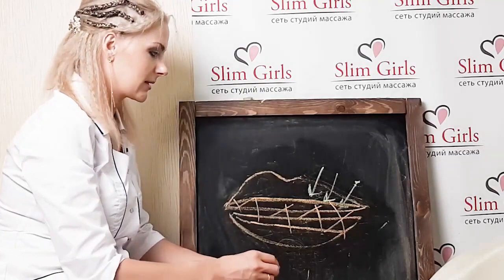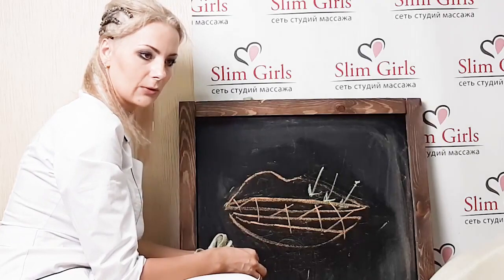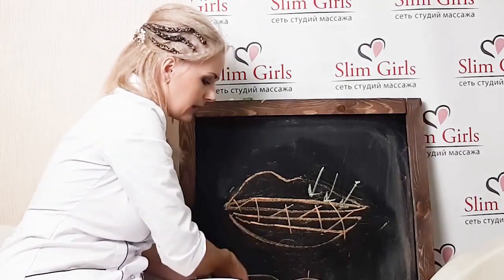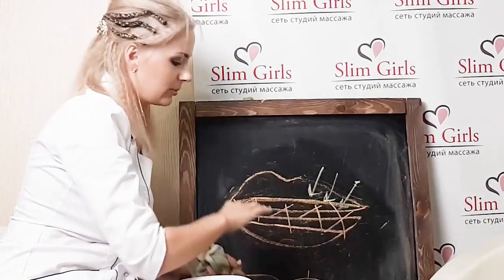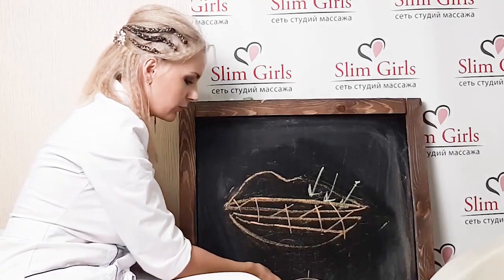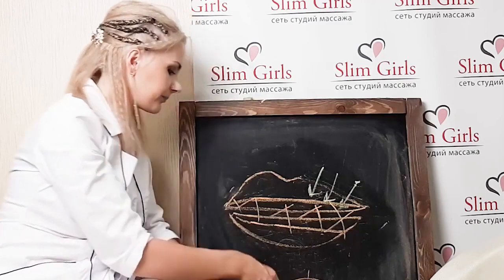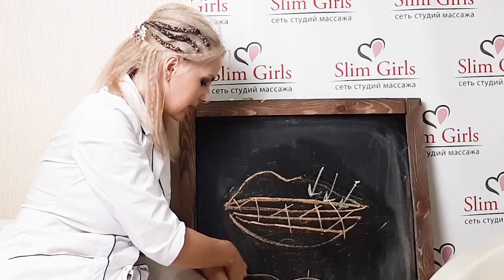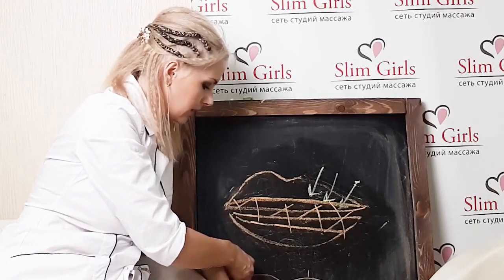Here's the same technique. When we go 1 millimeter higher, we can increase the volume when a narrow lip comes in. It is clear that we will not go along the contour and then fill this unfortunate volume. If she wants a wow effect, we will not go directly along the contour, but above the contour by 1 millimeter, and fill it all like this, that is, above the natural contour. You say that you cannot, but on the contrary, according to the technique, just here and fill.